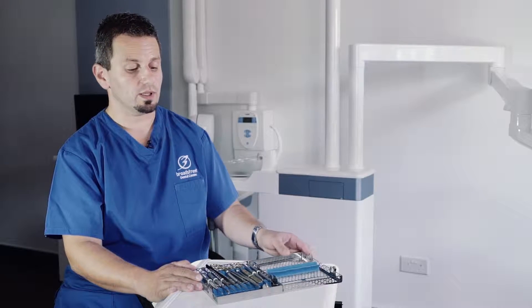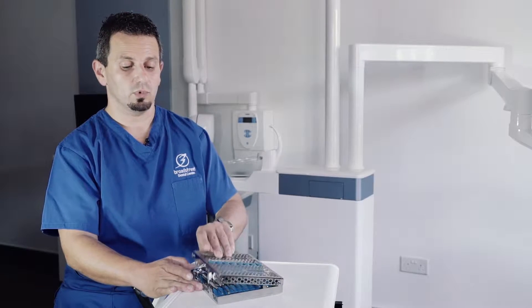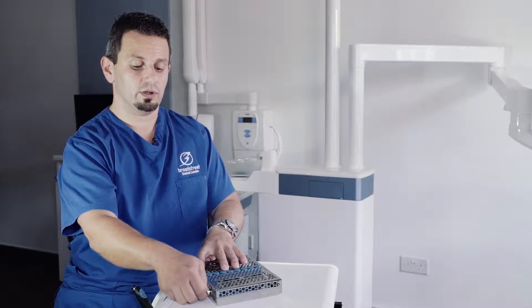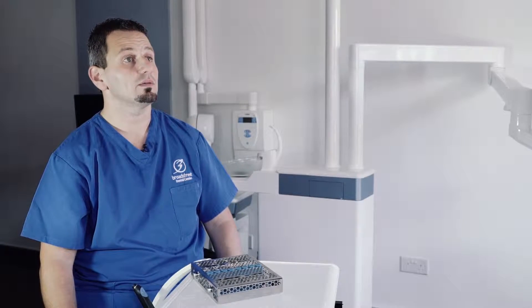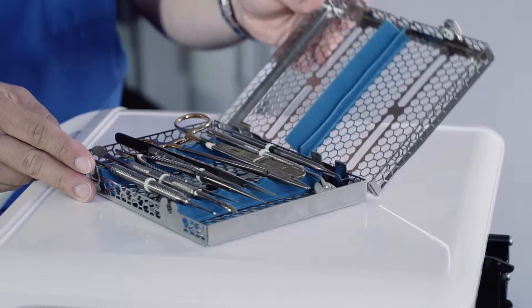Everything is packed in one convenient cassette. Once you're done, put everything in there, it's sent for sterilization, packed, and comes back perfectly organized for you to use it again.